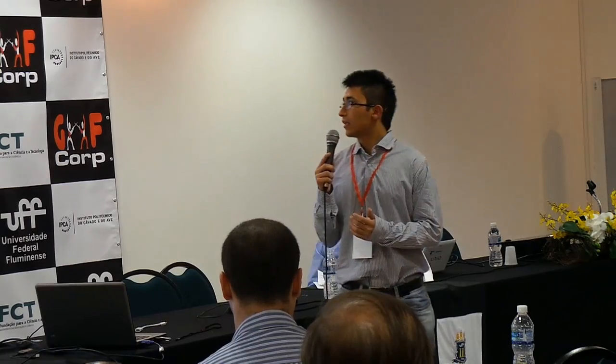So we use these tools to quantify the results. We use the Kinect sensor that allows us to capture 20 joints distributed in the human body shape and record motion capture data for posterior analysis using specific software designed by our group. It's called SeGAH, where we load the motion capture data and explore angular graphs to analyze one specific joint. In this specific study, we analyze the shoulder flexion.